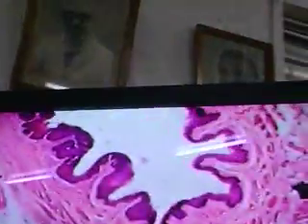So let's just go back to this for a while. Here now. So this is the lower third of the esophagus right here. That's all lower third of the esophagus that we're seeing. Now, we should be seeing some glands within the mucosa, but these are absent in this particular tissue. So that's right at the cardioesophageal junction, right here.